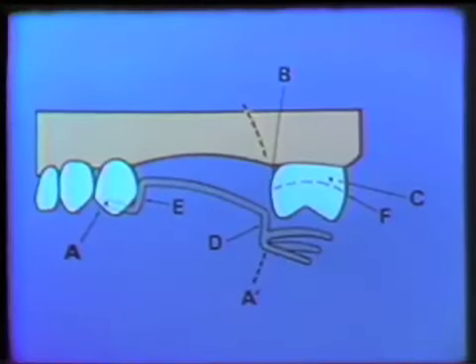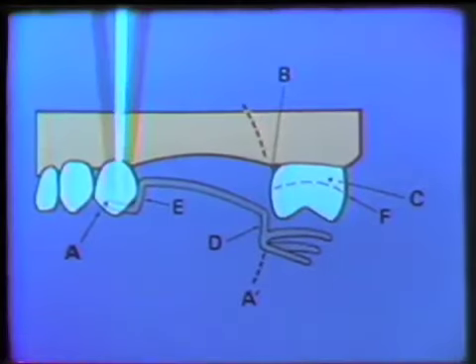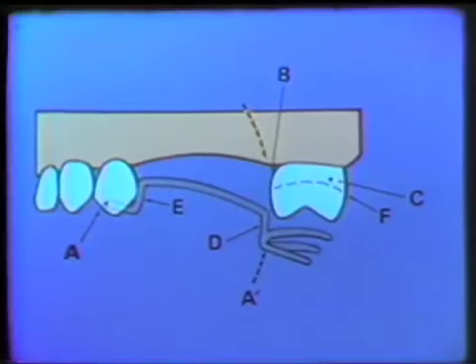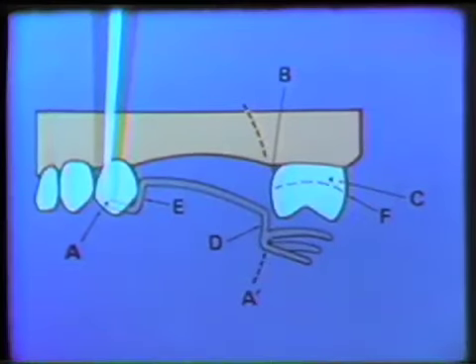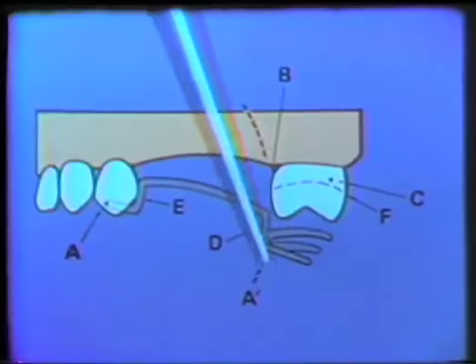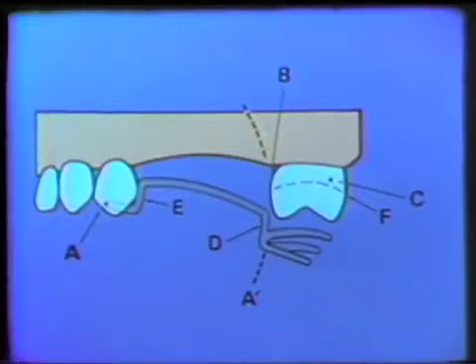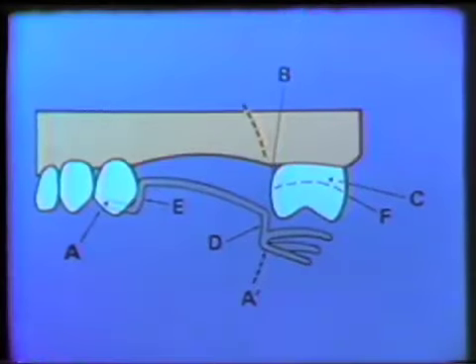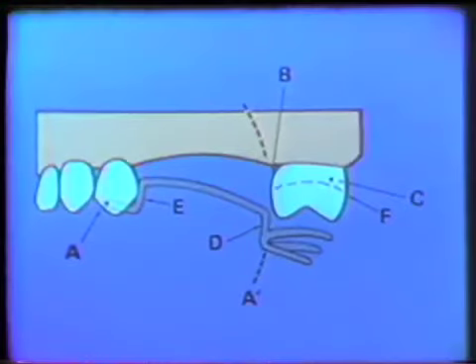Replacement of maxillary posterior teeth with a rotational path denture is accomplished in a similar manner, except that the framework will follow an antero-posterior rotational path of insertion. Point A is the anterior-most point of the long occlusal rest and is the center of rotation as the framework is rotated into position. A' is the arc of rotation, which the minor connector of the posterior clasp assembly will follow during seating. The letter B represents the space which must be blocked out in order that the minor connector can be seated without interference.